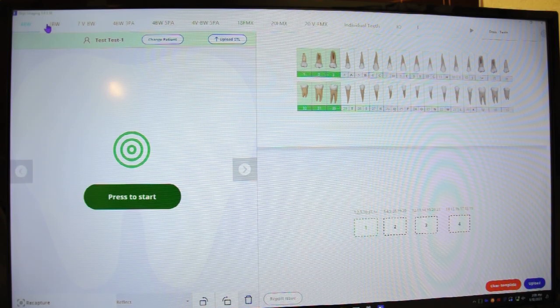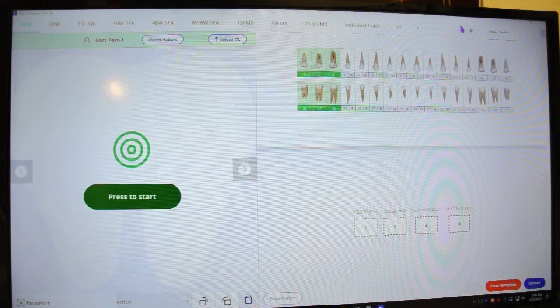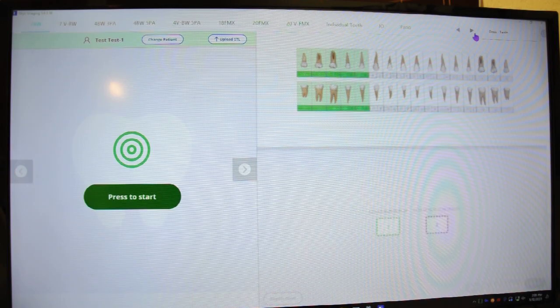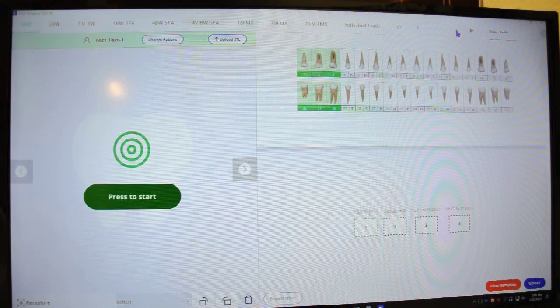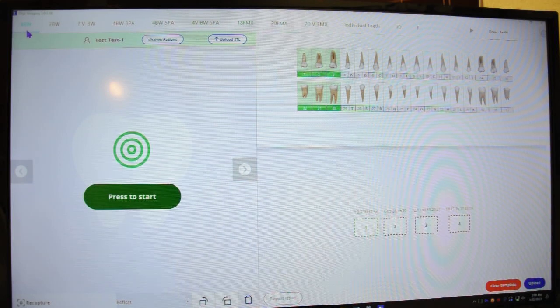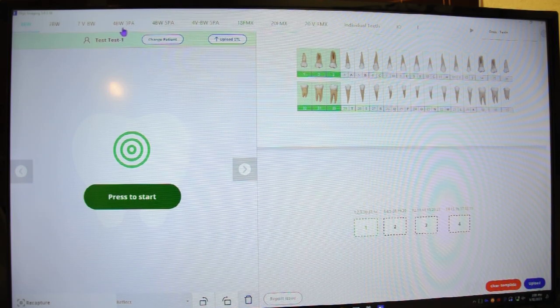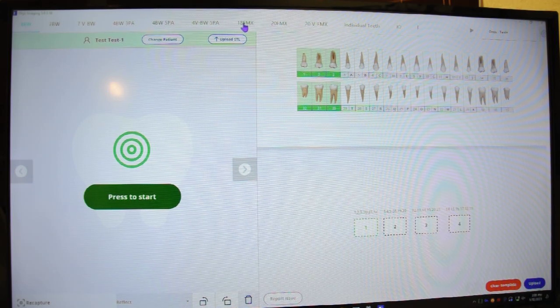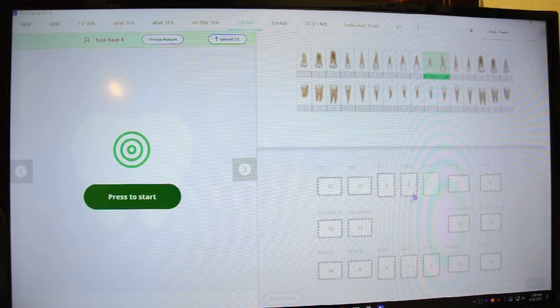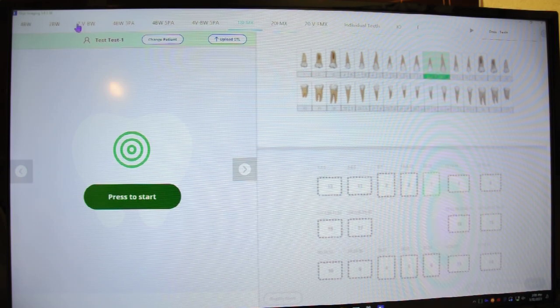And up at the top here, you see the different templates they have. Now, these are fixed templates. Unfortunately, I can't change them and customize them. You can do the 18FMX template, which is for new patients that we normally do.